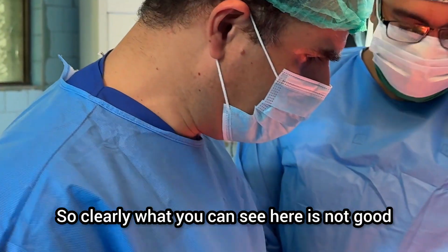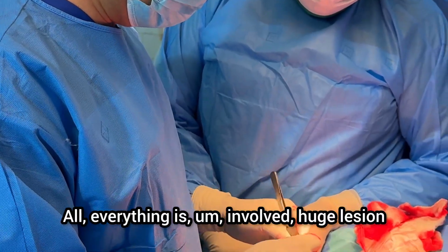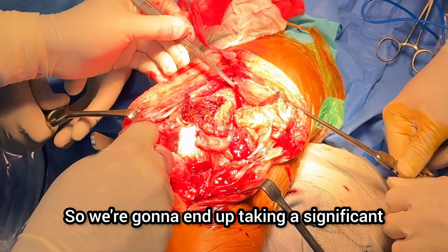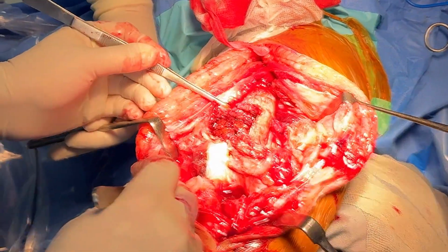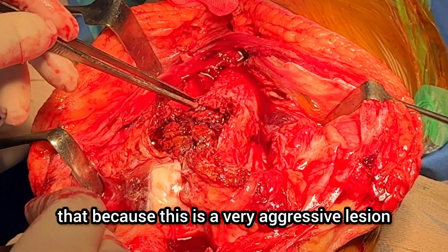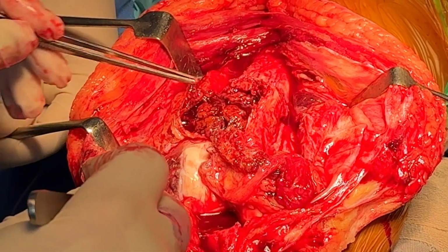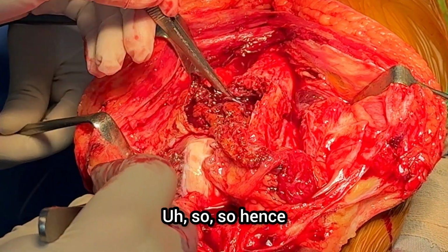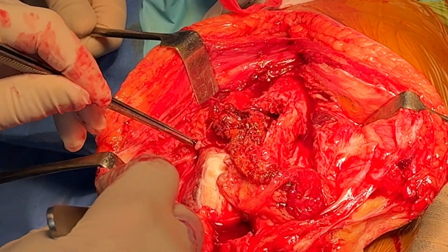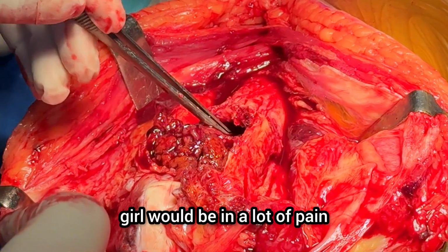So clearly what you can see here is not good. Everything is involved, huge lesion going all the way proximally. So we're going to end up doing the resection significantly proximal to that, because this is a very aggressive lesion. The whole knee joint is destroyed. You see all this is squidgy. Hence the plan to just replace this part of the femur. But very aggressive lesion, and a poor girl would be in a lot of pain.